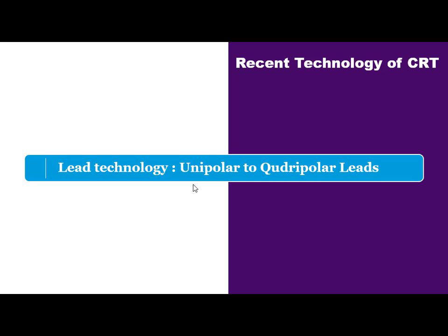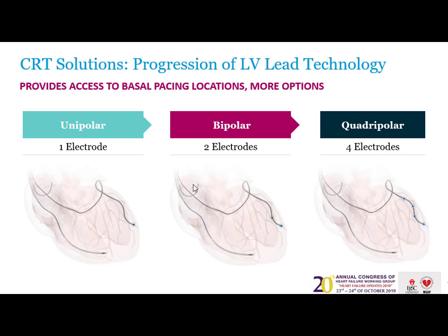Then they went to bipolar lead, and then to quadrupolar lead, and if I have the facility, I prefer the quadrupolar leads. First, you can go inside the vein down, and you choose the poles you like. Second, if you have phrenic nerve stimulation, you can escape it. For my fellows who were not there when Mazen was doing his MD thesis, this is the unipolar coronary sinus lead, this is the bipolar, and this is the quadrupolar lead.